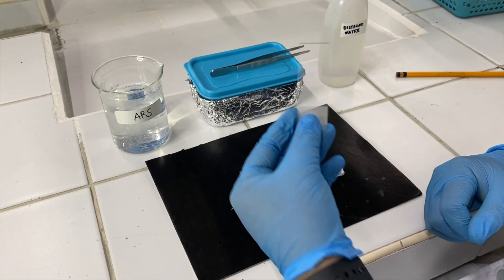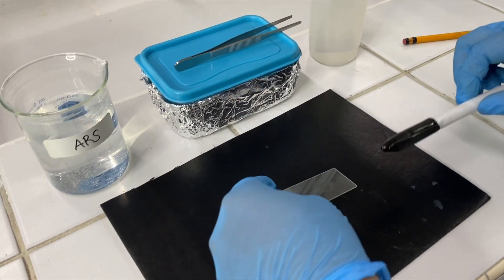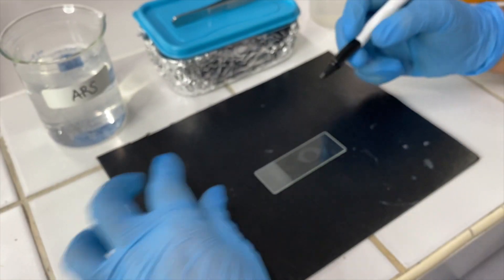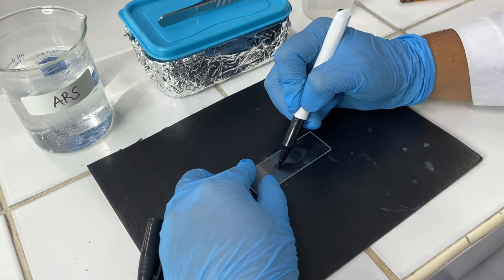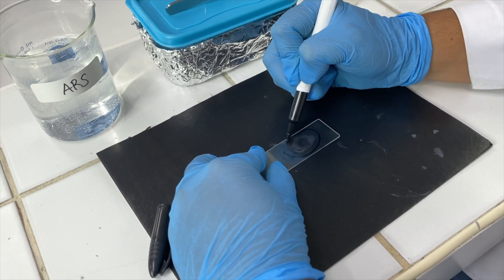Next, outline the area around the tissue section using a PAP pen. This creates a barrier ensuring that the reagent is confined in a defined area. Make enough allowance between the tissue and the margin.